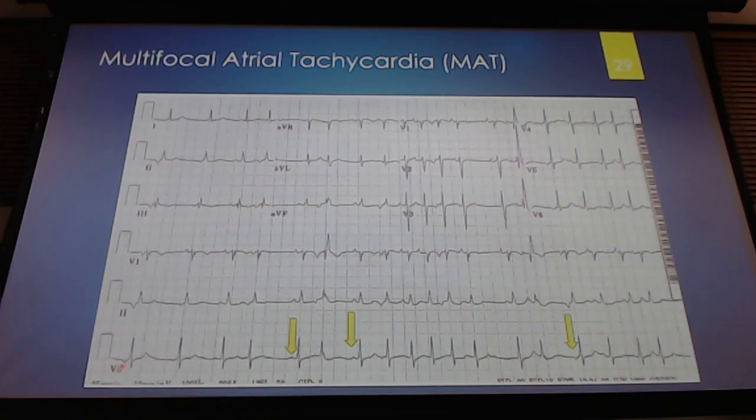Maybe what you're thinking, retrograde depolarization. So in other words, we have depolarization that comes down, but then we'll have some depolarization that comes back up to the atria, and it causes those atria to depolarize, but it's going to be inverted on our ECG. So we see an inverted P wave here, and how do we know it's a P? Well, it's a little bit hard maybe, but we have a QRS complex right after it, and then we have a T wave, so that's your indication that's probably a P. We don't really see much of a P wave here. We see a P wave here where it's upright, so that's one different kind of P wave.